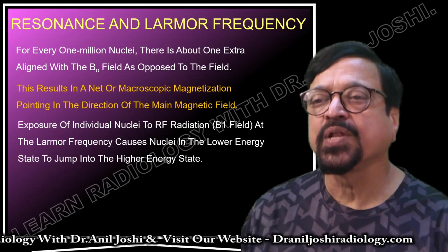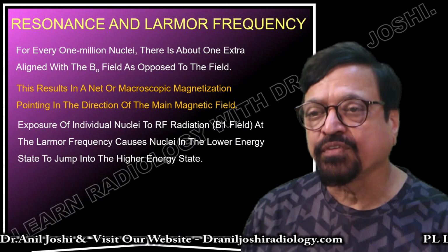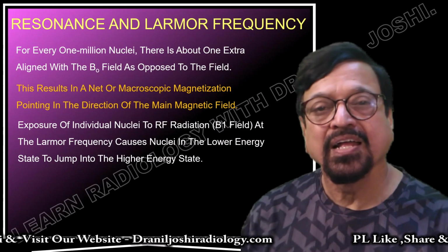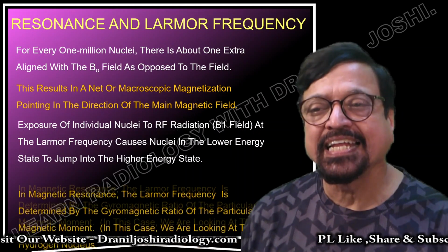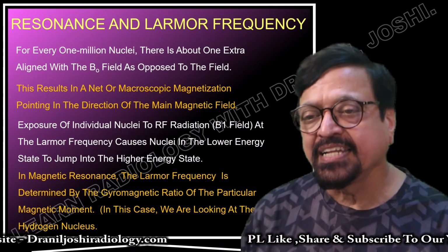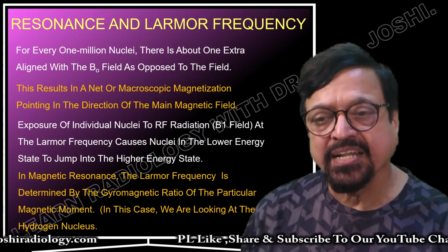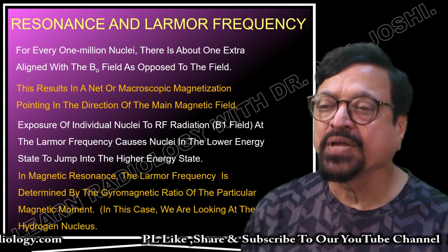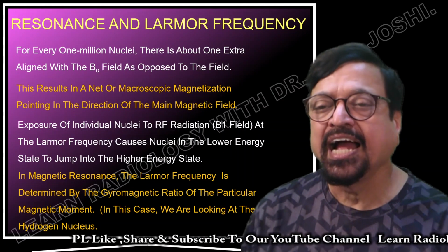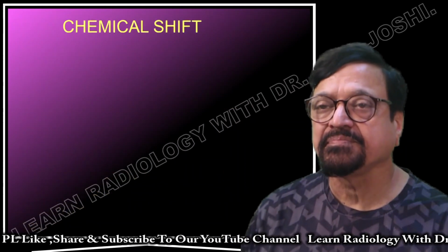Exposure of the individual nuclei to RF radiation, that is the B1 field, at the Larmor frequency causes nuclei in the lower energy state to jump into the higher state because they gain the energy. Now in magnetic resonance, the Larmor frequency is determined by the gyromagnetic ratio of the particular magnetic moment. In this case, we are looking at a hydrogen nucleus. They are abundant in the body and they are the main source for the MRI.